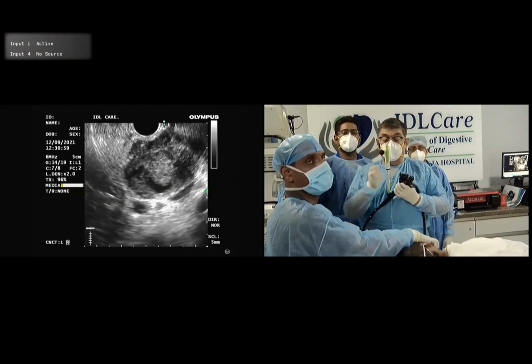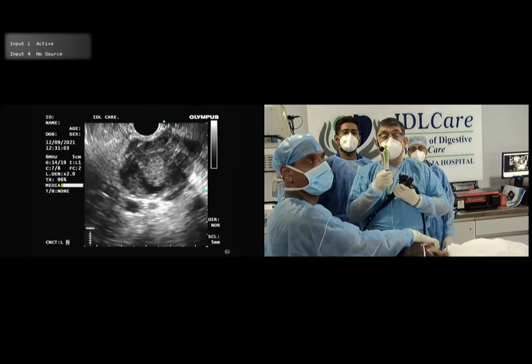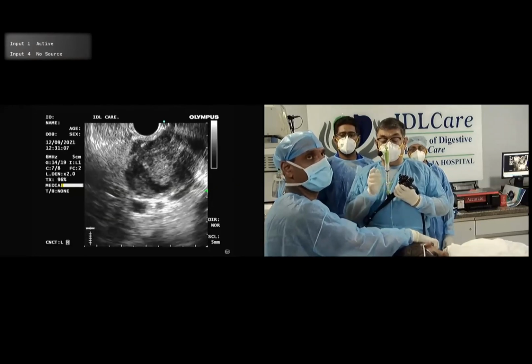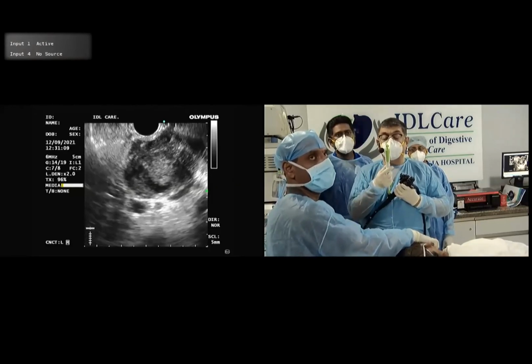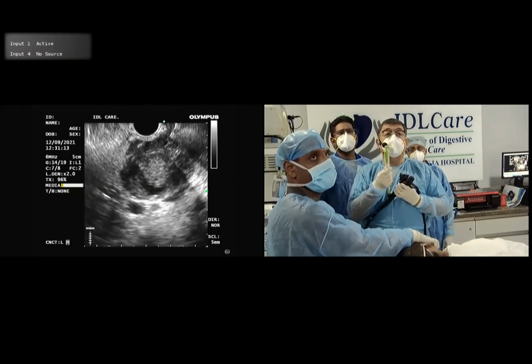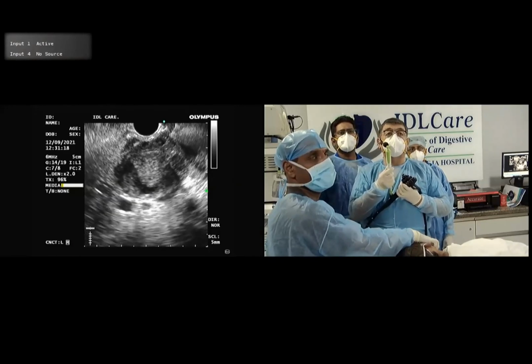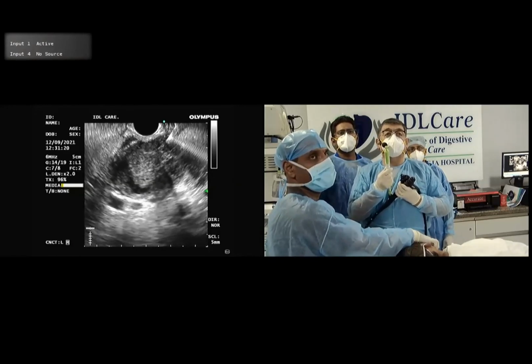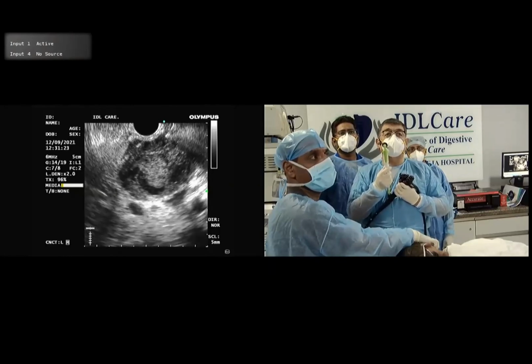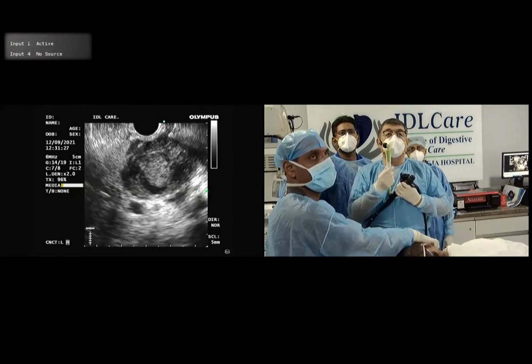Then you release the lock. As Rajesh explained yesterday, I use my middle finger. See, this is my middle finger as a lock. So I don't use this lock, middle finger, and with the thumb and index finger, I first gently take out the needle to see what is the trajectory of the needle. See that blue mark, you see the trajectory of the needle. This looks okay. Sometimes from the stomach wall will go in. So your jab should be quick.